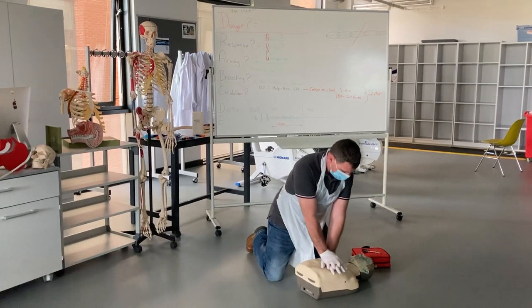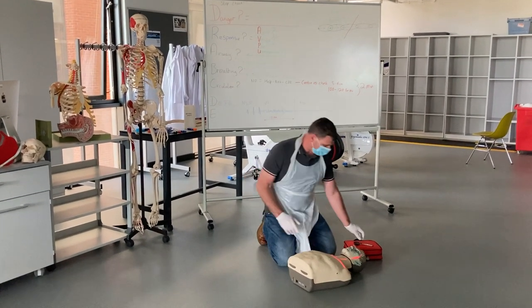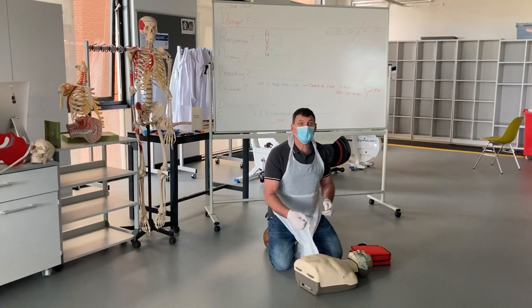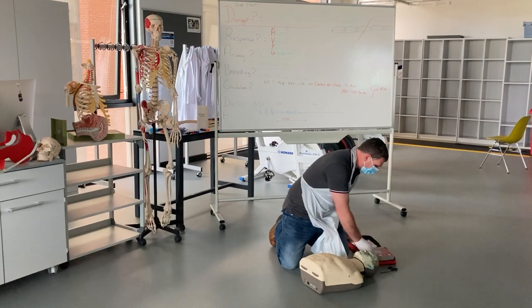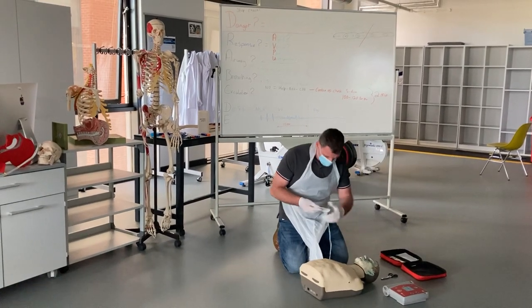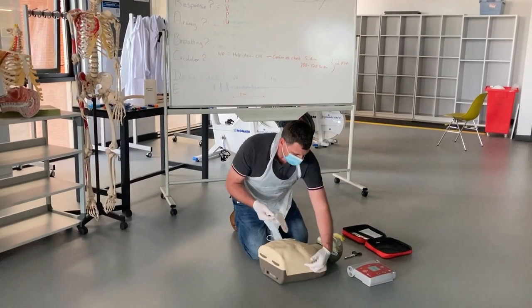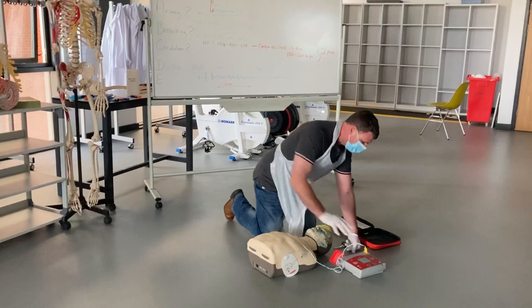If I had someone else, I would have asked them to get the defibrillator while I started chest compressions. Now that the equipment has arrived, I ask the other person to carry on chest compressions while I prepare the AED. I make sure the chest is bare and check for perspiration, patches, pacemakers, piercings, pendants, or excessive hair. I switch the AED on early. One pad goes just below the right collarbone, the other pad goes underneath the left armpit, beneath the left breast.